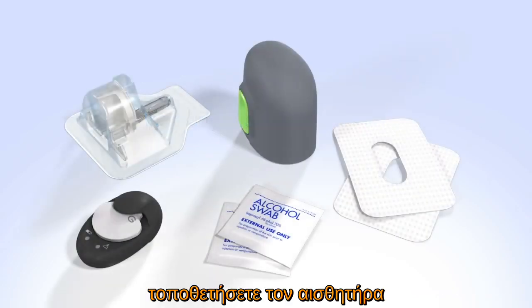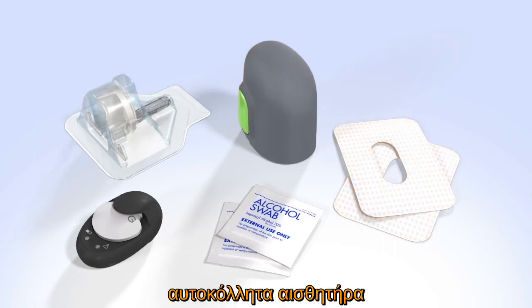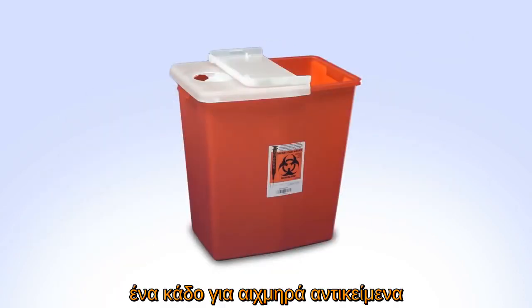When you are ready to insert your sensor, gather the following supplies: an N-Lite glucose sensor, the One Press Sertor, sensor overtape, a Guardian 2 link transmitter that has been fully charged, an alcohol wipe, and a sharps container.